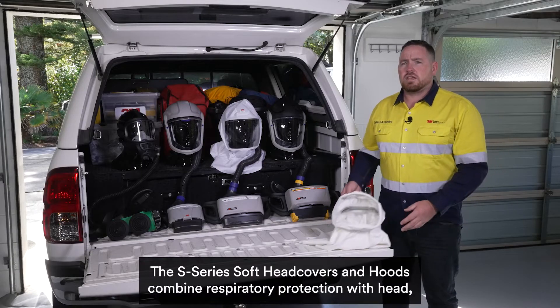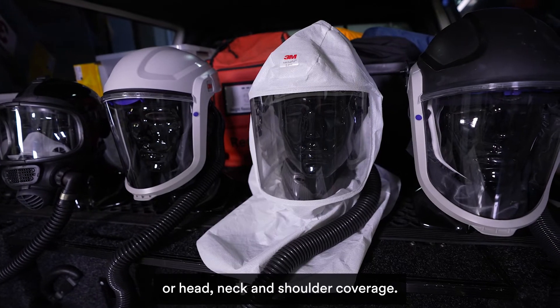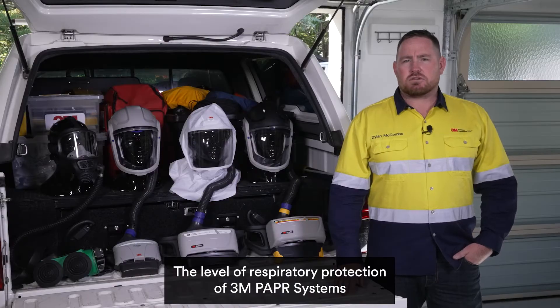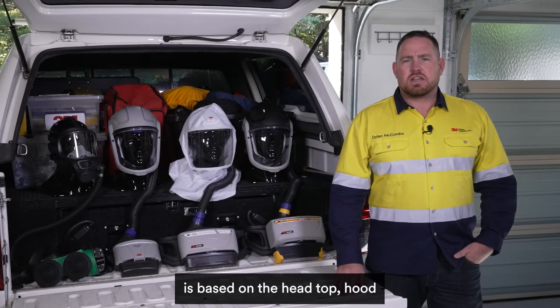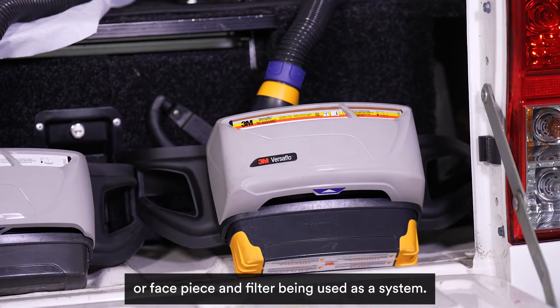The S-Series soft head covers and hoods combine respiratory protection with head or head, neck and shoulder coverage. The level of respiratory protection of a 3M PAPR system is based on the head top, hood or face piece and the filter being used as a system.